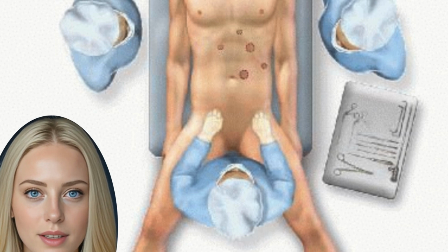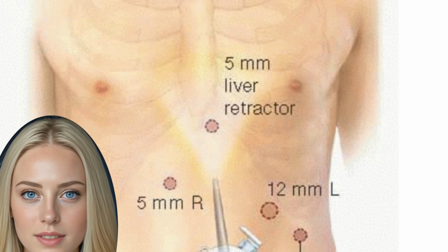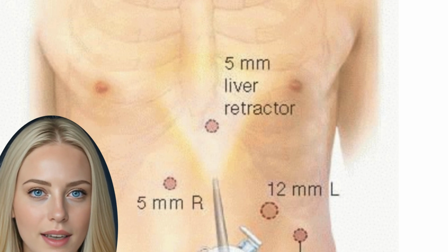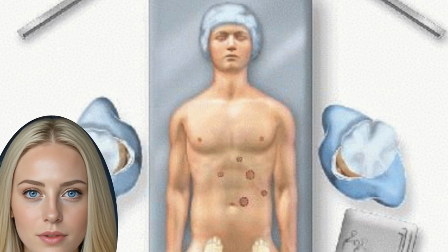Instrumentation. As aforementioned, there can be up to a 20% enterotomy rate during PEH repair, especially during redo operations. Therefore, extraordinary care is tantamount to establishing safe dissection planes, especially near the esophagus. Ultrasonic shears are the mainstay of dissection, Harmonic ACE curved shears, Ethicon, Somerville, NJ, whereas when operating extremely close to organs, we advocate switching to laparoscopic scissors as well as blunt dissection to avoid thermal injury.